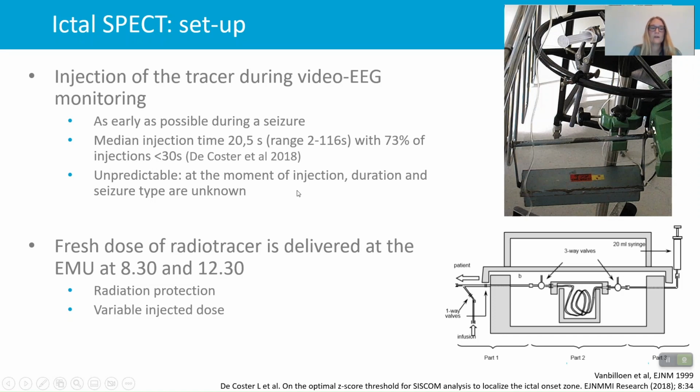In our center, we have the availability of the tracer from Monday to Friday from 8:30 till 4:30, and we get a fresh dose of radio tracer delivered at the EMU at 8:30 and at 12:30.